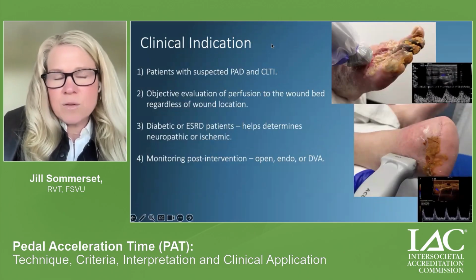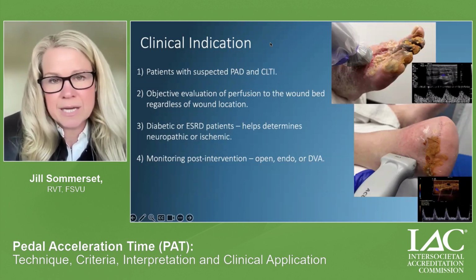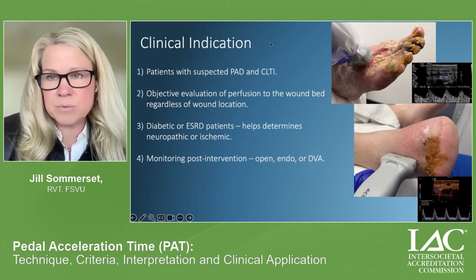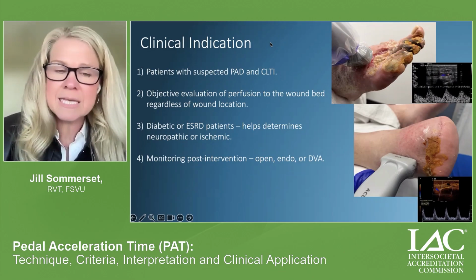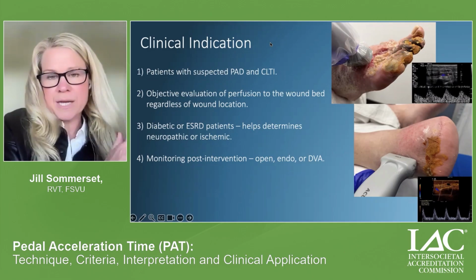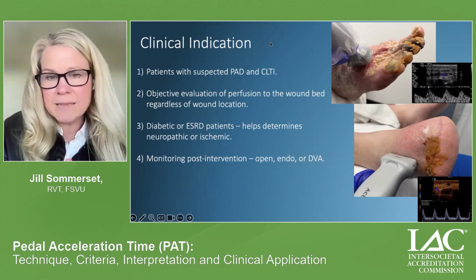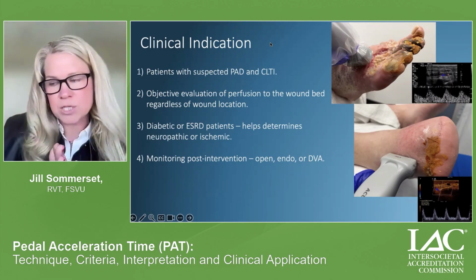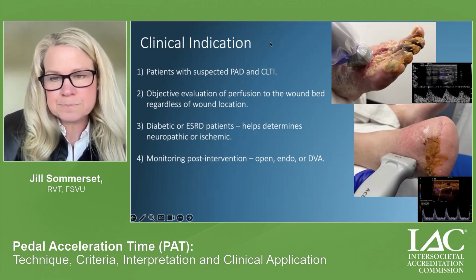So for PAT, there's huge clinical indication in patients with suspected PAD and CLTI. I think in the wounded patients, patients with diabetes and renal failure, this really can provide so much value. And the nice thing is we can use PAT to really monitor our patients, not only pre-procedure, we use it inter-procedurally in the cath lab, but also post-procedure as surveillance as the patient is going throughout their wound healing journey.